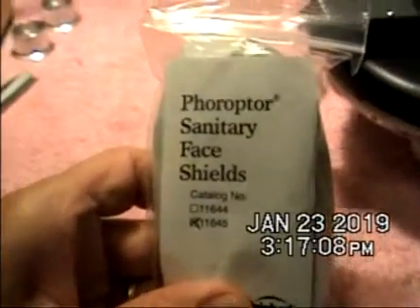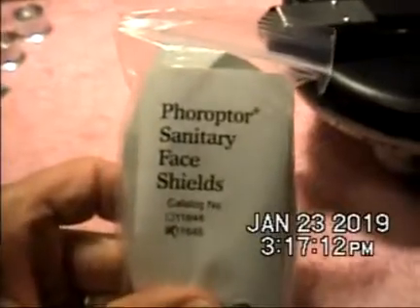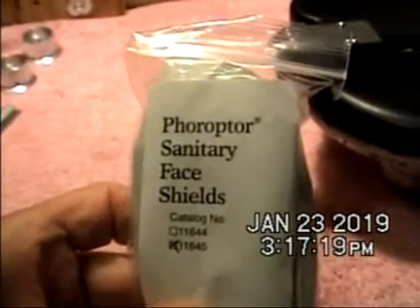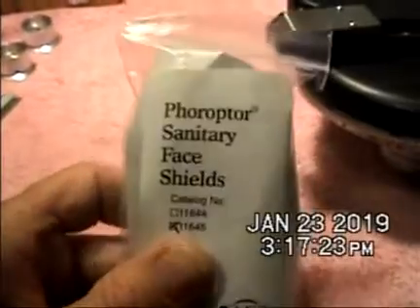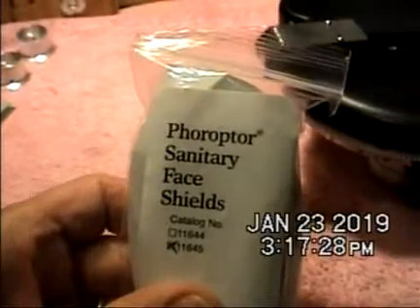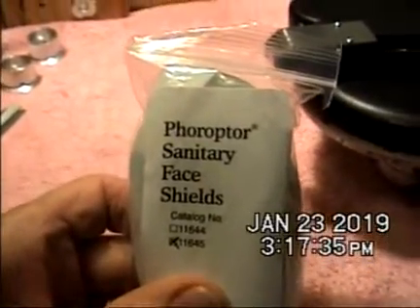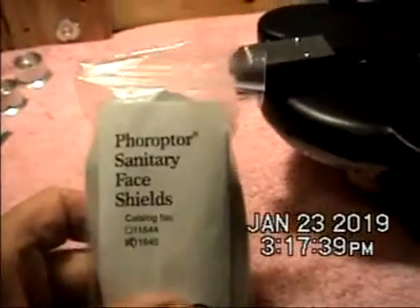In 2015, I communicated with Reichert about their sanitary face shields and how they didn't really stay in place. The problem seemed to be that the face shields had been made too thin over the years. They originally were about a millimeter thick around 1990, and then in the ensuing couple of decades, they were making them too thin to work.